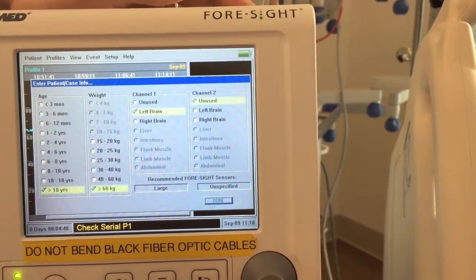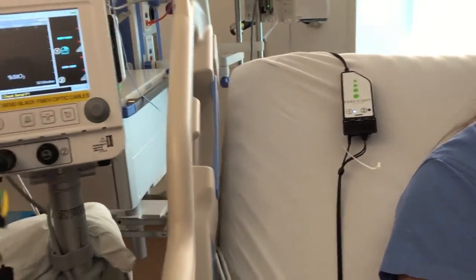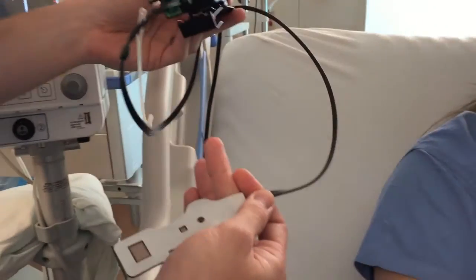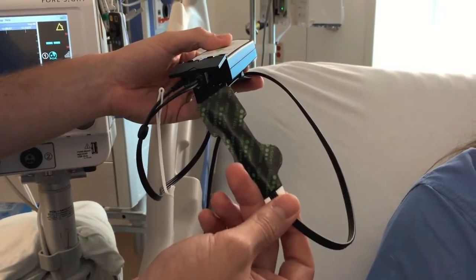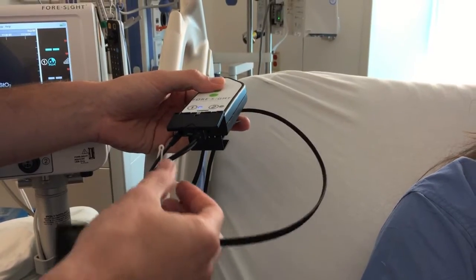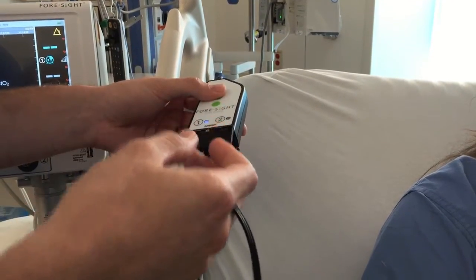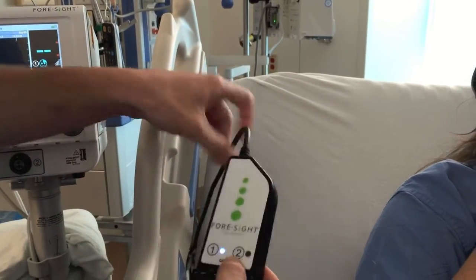The monitor recommends a large foresight sensor for this patient. We can go ahead and select done to clear that screen. The sensor cable connects to our NIRS sensor, which can be found in the Pixis supply room across from bed space 4. We've selected the large sensor as the monitor indicated — it will not let you use anything but the large sensor once you've entered the patient's age and weight.